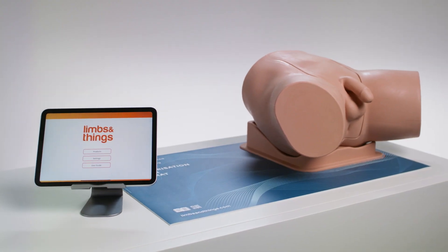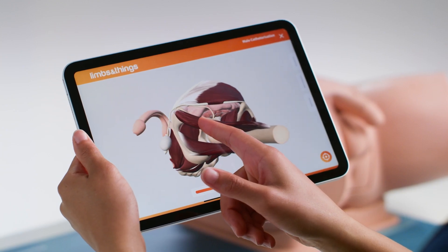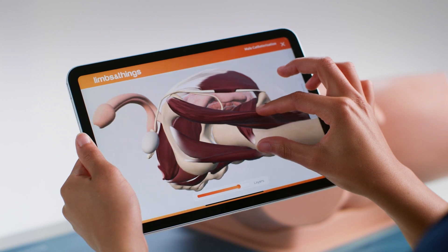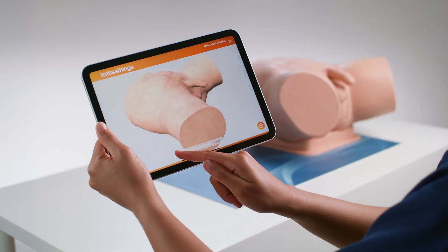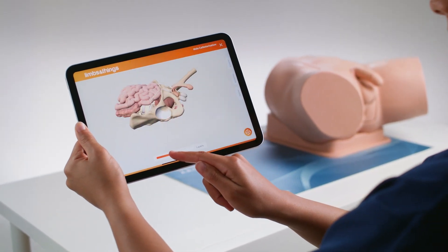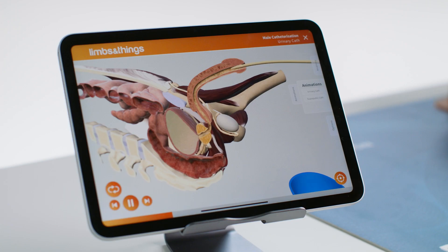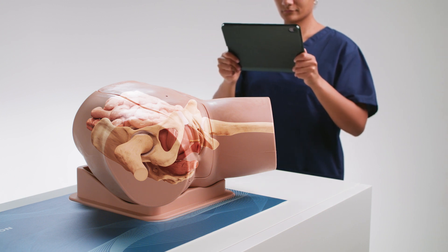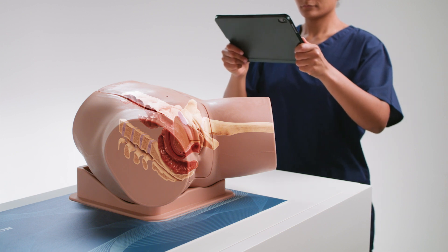Compatible with Limbs ART, augmented reality training, allowing trainees to view the internal anatomy of the urinary tract and surrounding structures, increasing anatomical and procedural knowledge. The interactive anatomy gives the ability to view under the skin with normal and pathological anatomy. Animations show the insertion of a catheter through the urethra and suprapubic insertion. Augmented reality overlays the internal anatomy and animations onto the product, giving a new immersive dimension to training.